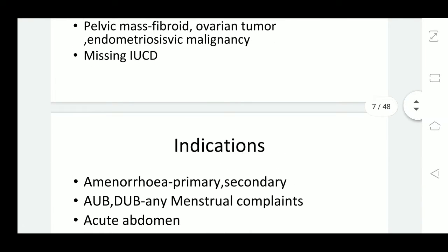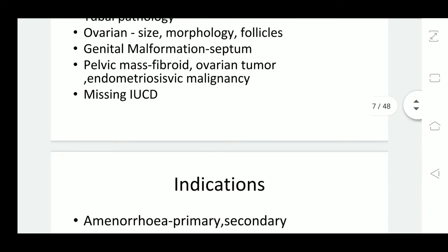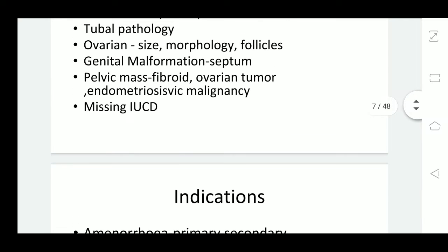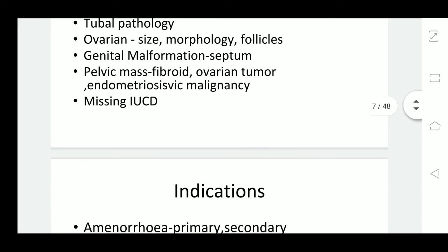Missing IUCD can also be assessed on ultrasound. When a patient comes with history of IUCD but she is not able to feel the thread, or on examination we do not see the tail of the IUCD, we can do ultrasound to see whether the missing IUCD is visible and if so, where it is located.